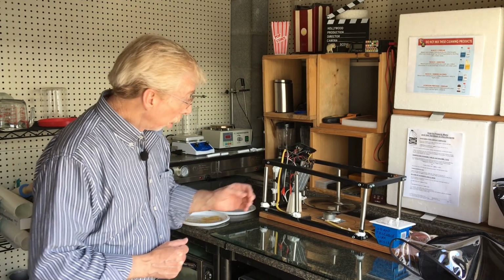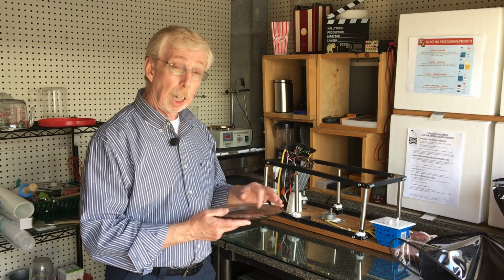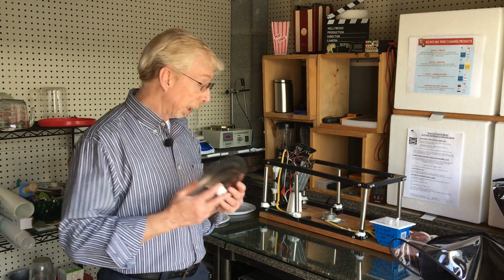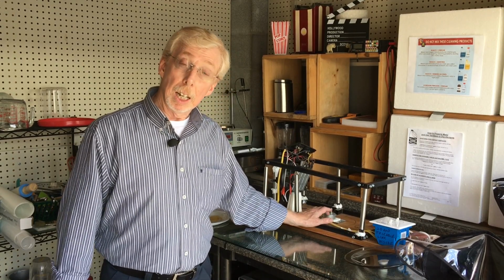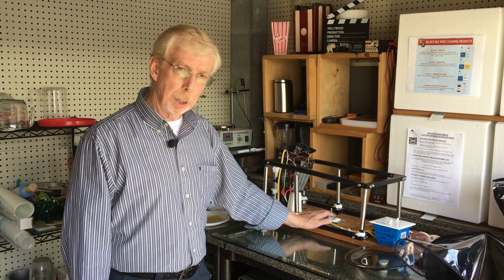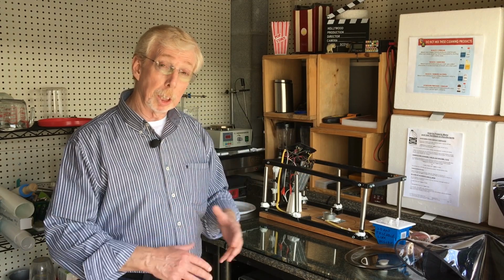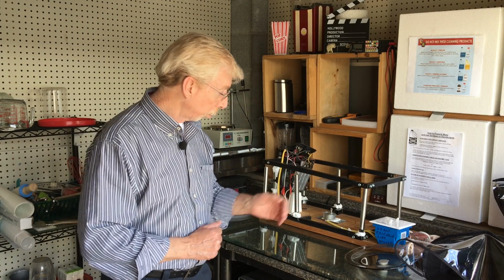Now, what I have here is just a glass plate. And my go-to stuff is definitely silicone for adhesives and things like that. This is just a bare microwave motor. It rotates at 2.5 RPM. Now this will rotate a different direction with every stop of the motor. It will start in the next direction, back and forth. So be aware of that.